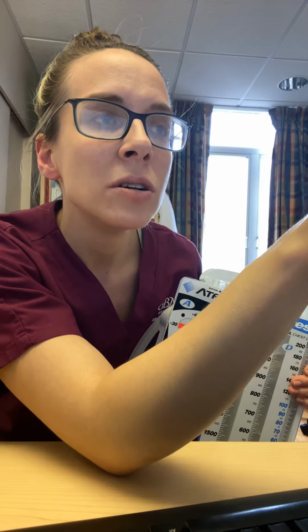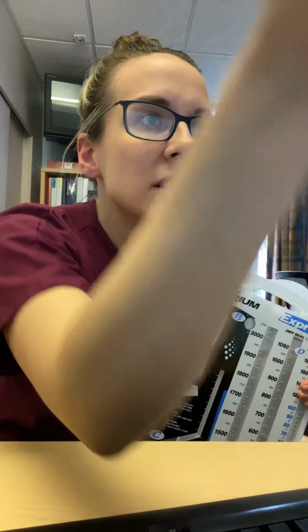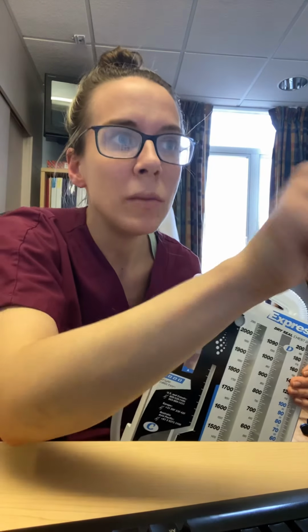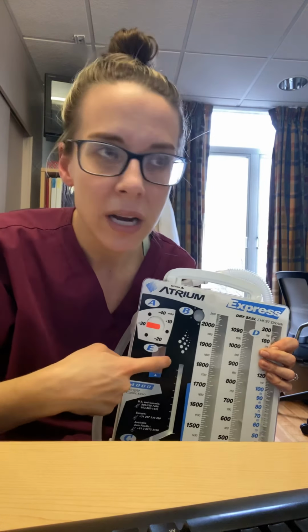The one all the way at the bottom picture, the suction gauge all the way to the left, turns on by sliding the lever along the top. I think you can see right now it's in the off position. If you turn it to the left, it looks like it's going to be on regular, and the other way, I think, intermittent. But anyway, that's how you would turn it on. And then the black dial on the bottom, you push it in and turn it to get it to low, medium, or high. Again, we're aiming for about 80 minimum, or whatever it takes to get the bellows visible in this window.